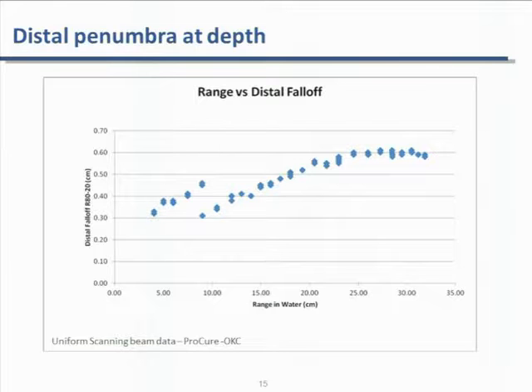This is important clinically because when you do patch fields, the cold and hot spots are completely controlled by the interaction between this distal fall-off and the lateral penumbra as well.